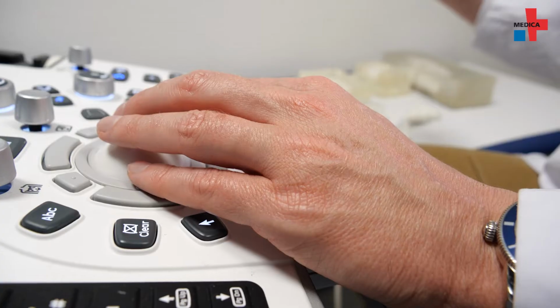Talking about the costs, we calculated it for example for the temporal artery vessel which we designed for early diagnosis of giant cell arteritis. Here the total cost including the resin, the special gelatine where it is embedded, and the energy cost and also partial cost of the 3D printer, we landed at €5.60. So it is still quite cheap for a medicinal early diagnostic product.